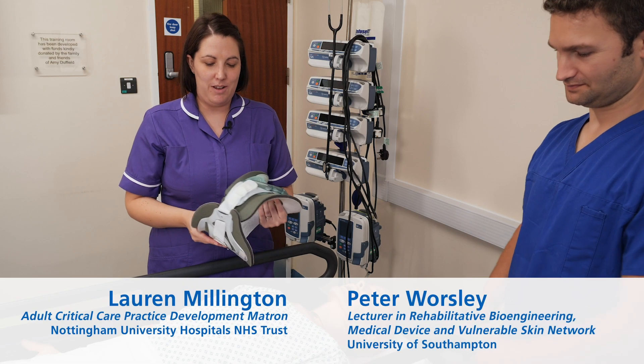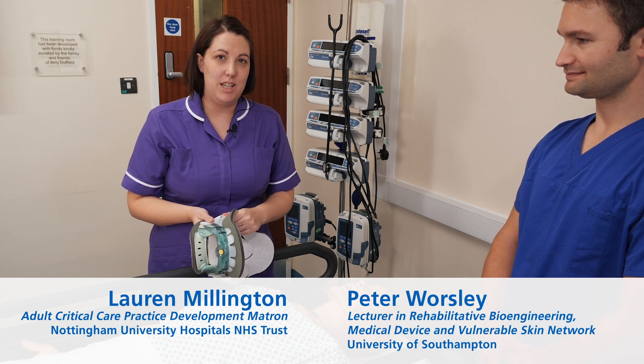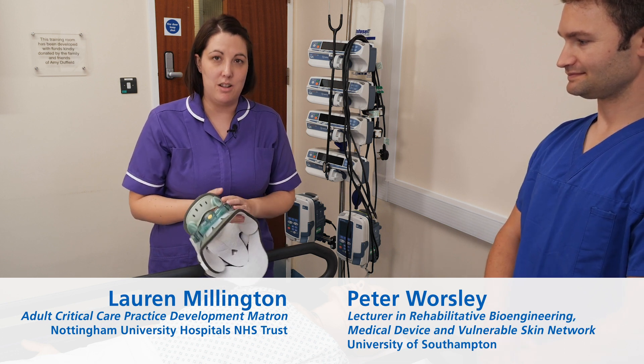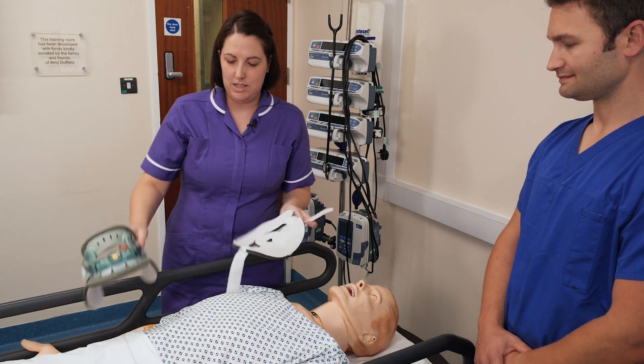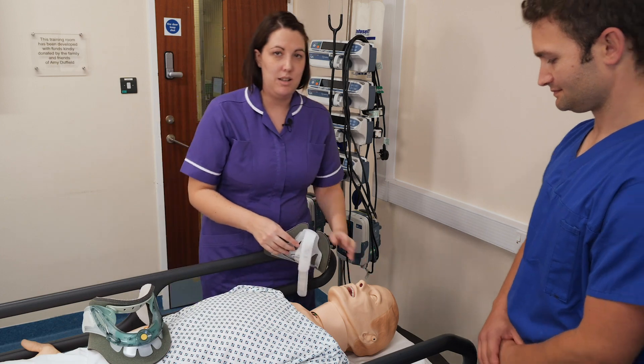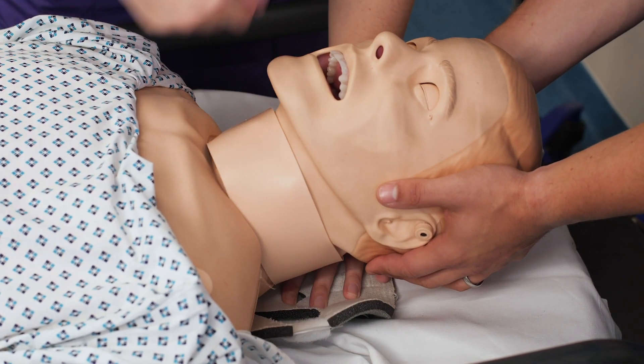Hi, I'm Lauren and I'm going to talk through how to apply a two-piece collar and some of the considerations when the patient is being nursed with a collar. The two-piece collar comes in two pieces. You always need to make sure that somebody's around to hold the head when you apply or take your collar off.